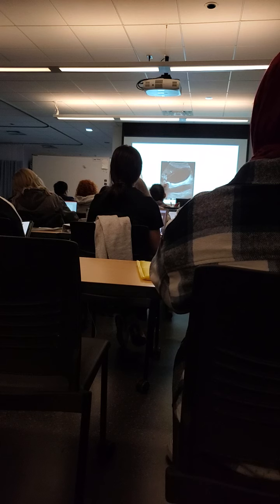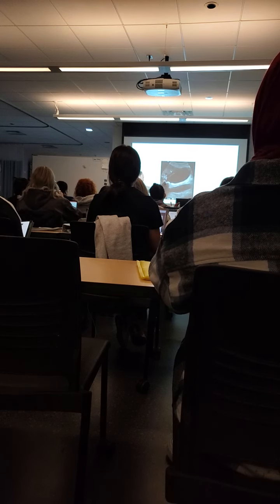So in the neck of the gallbladder, we have a significantly blocked neck with an echogenic shadowing foci, and then we've got a little bit of wall abnormality here, but you can see just how plump this looks. So our slug is kind of inflated a little bit. So it's a stone right there? Yep, there's a stone right in the neck. So echogenic shadowing foci. Now, what is it on the top?